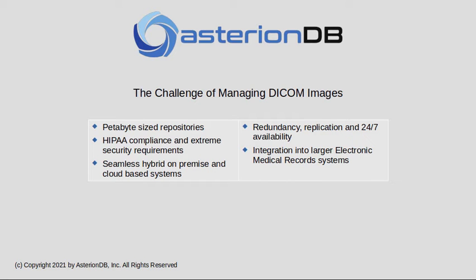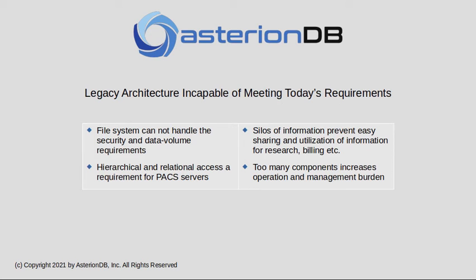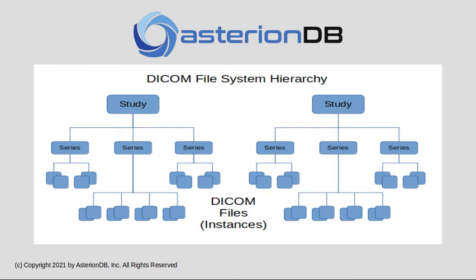With large data sets and extreme security, the patterns and techniques that have been employed in the past are no match for today's requirements. Systems today have to provide 24/7 availability, long-term secure storage, and be easily integrated into other electronic medical record systems. DICOM is a unique format that by its very nature imposes a strict hierarchical relationship, as you can see here. However, data must still be accessible in a relational manner.